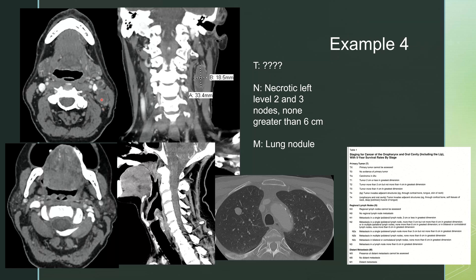Example four: on the CT scan, we see necrotic left level two lymph nodes extending to level three. The largest measures greater than three centimeters in its maximum dimension, but none measure greater than six centimeters. We don't see a primary lesion on these images evaluating all of the oropharynx. However, at the lung apices, we see a mass that could possibly represent a metastatic lung nodule. So we have a TX tumor — we're not sure where the primary tumor is — lymph nodes greater than three but not greater than six centimeters, and at least one distant metastasis.